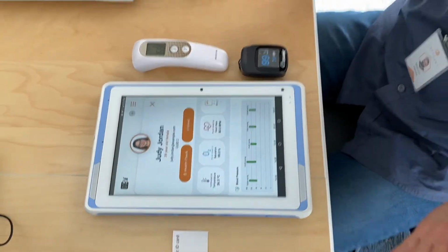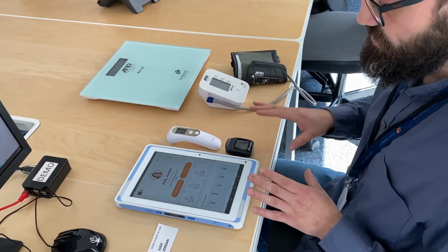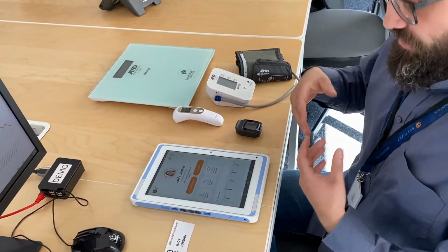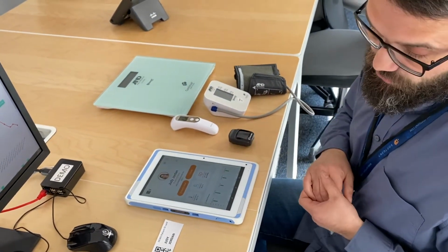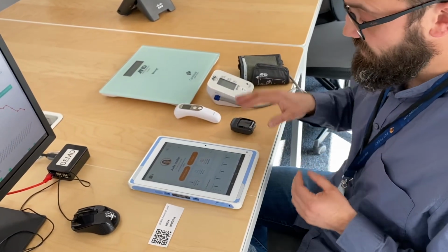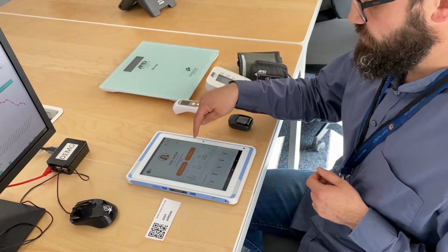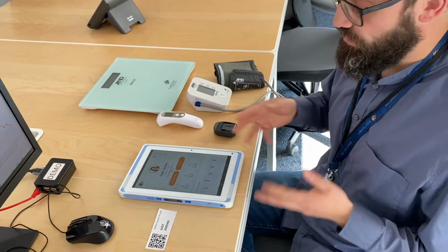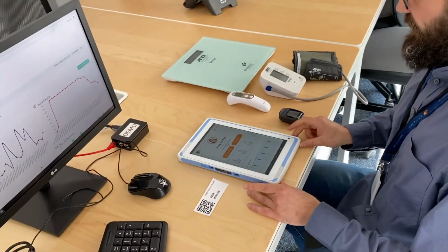So that's basically how easy it is for users to interact with the system. You can envision this mobile app to provide more features. You can, for example, have pill reminders, or you can have patients give subjective scores of their health status. I have a headache, I have muscle pains, etc. You can also envision this app to enable a channel for communication with the doctor. It can even enable calls with medical specialists, and so on.